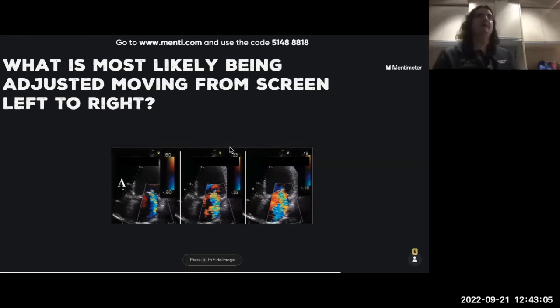On our machines here, if you press color Doppler, then along the side, you may not notice, but what pops up is basically color Doppler and then power Doppler. So if you're ever just thinking, is there flow? I don't care about direction. Just power Doppler is very, very easy.